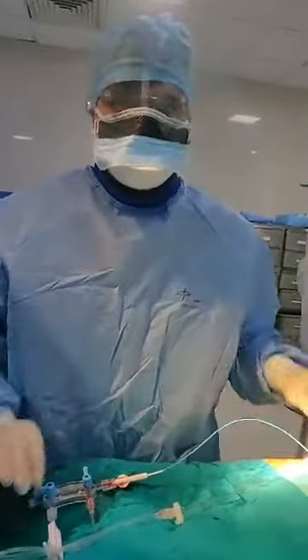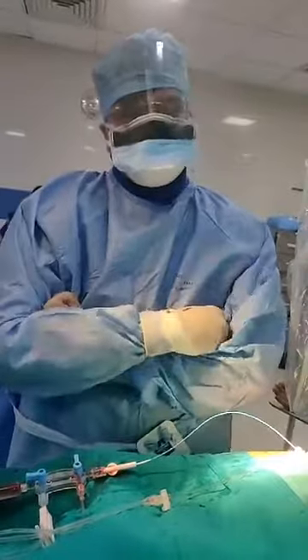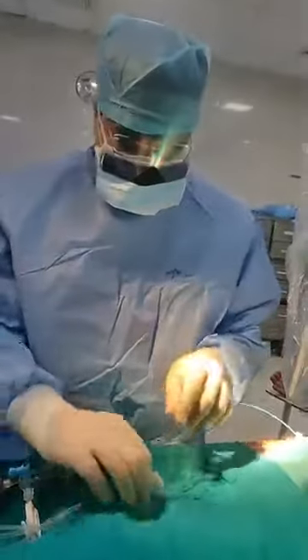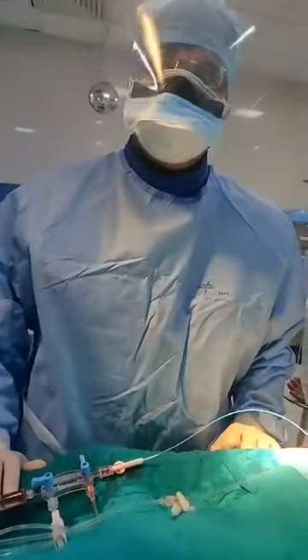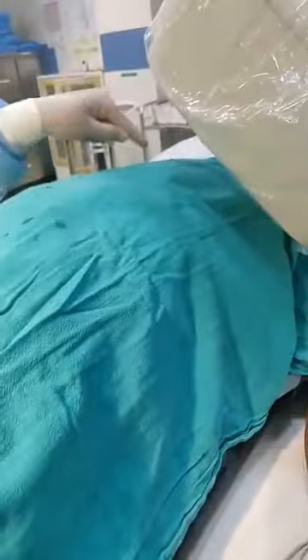Angiography is a procedure done to find out coronary artery blockages directly. Echocardiography will tell you the heart pumping function. TMT will give you the possibility that the patient may be having blockages. But to directly see the arteries, the best way is only angiography. With the help of the catheter, as I explained, it goes to the femoral artery and then from there into the heart.